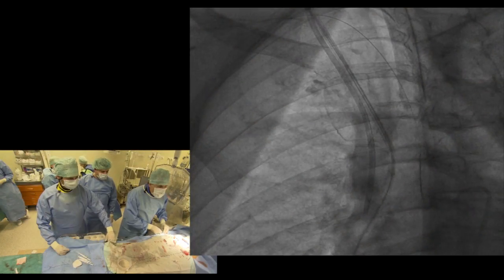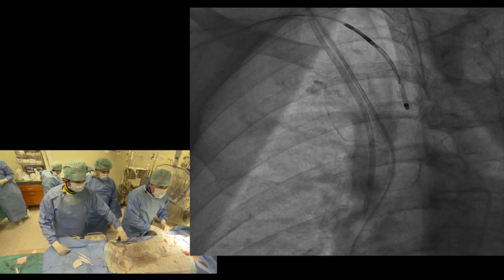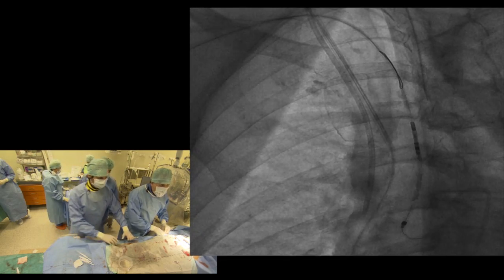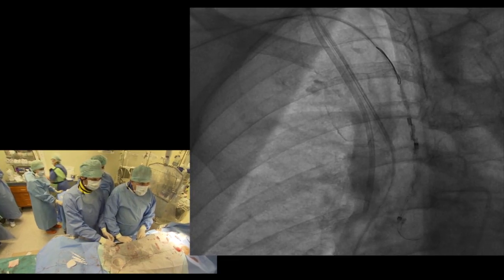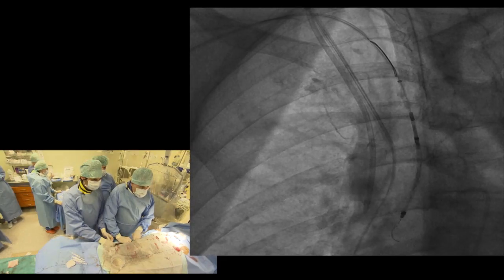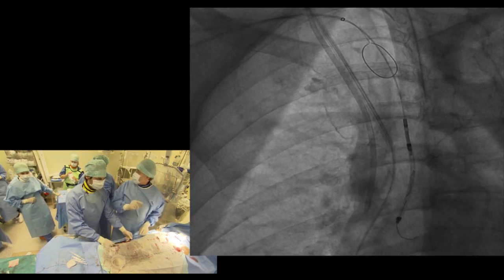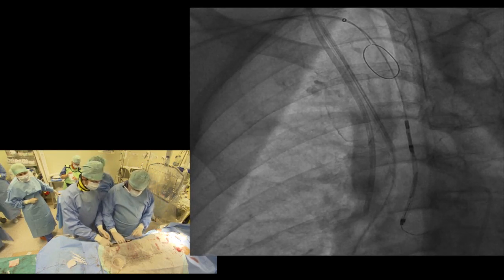I'm going with the system now. That's very good. Still, maybe. Okay. Still. Somewhere here. I think we can now open it. Yes? You unsheath it, so to say? Yes, I unsheathed the proximal one. So that's easy. It is the easiest part. Now we have to go back with the blue part. Yeah, exactly. Through the hole.